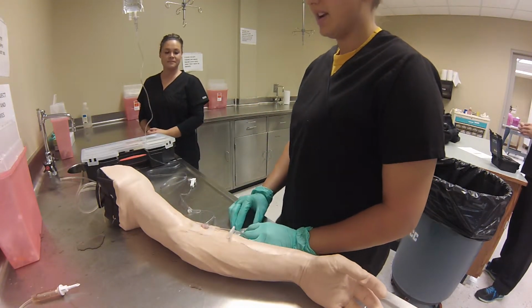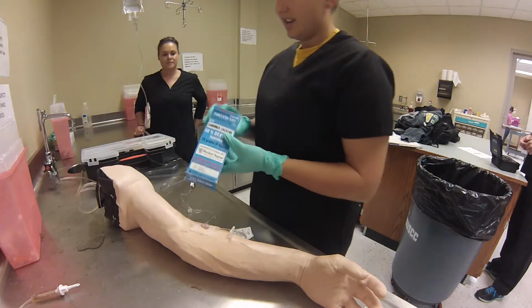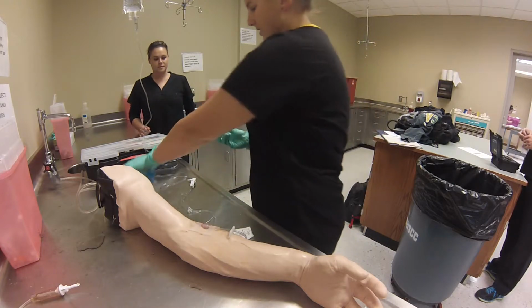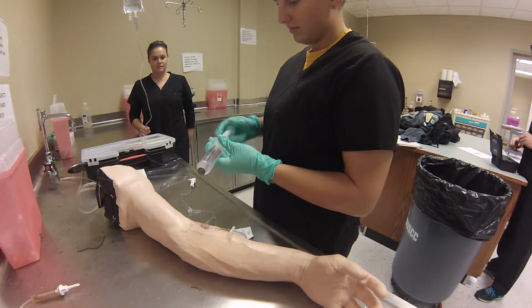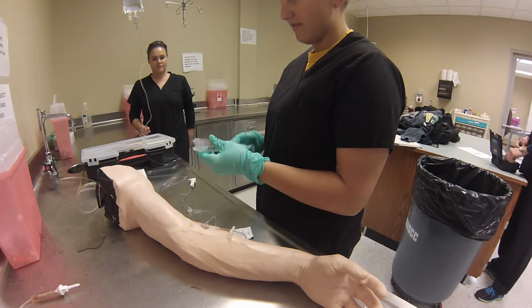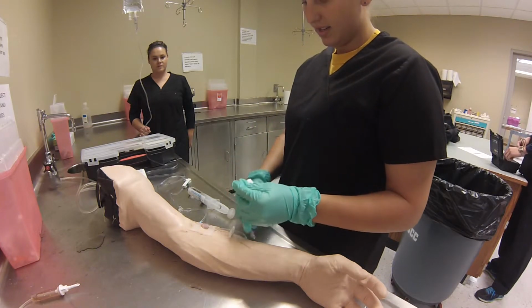None. Okay, from here I'm going to go ahead and get my D50 out. So I'm going to find the D50 and I'm going to go ahead and assemble the syringe together. All right, I'm going to administer 25 grams. From here I'm going to go ahead and clean my site.